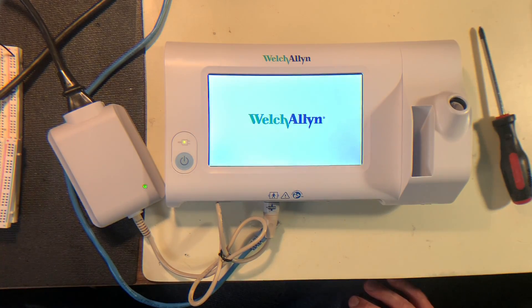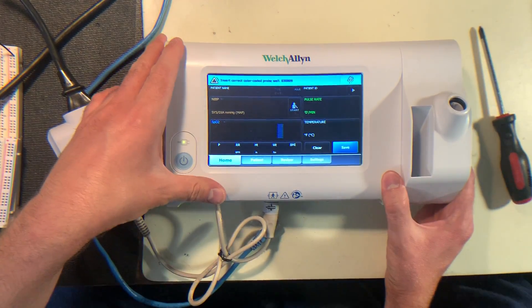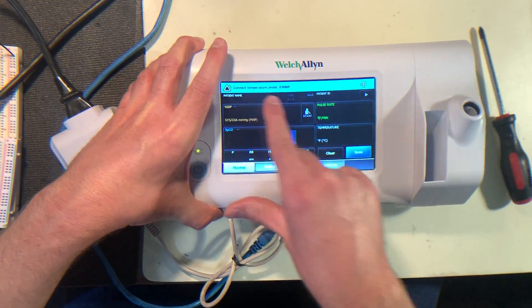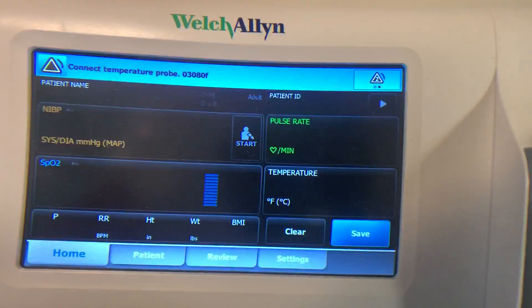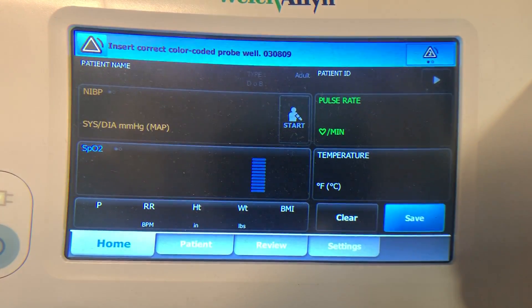They're not really the fastest thing to start up in the world. You can see here that this is the main interface. Up here at the top, it's already showing that it's complaining a little bit because we don't have the temperature probe.